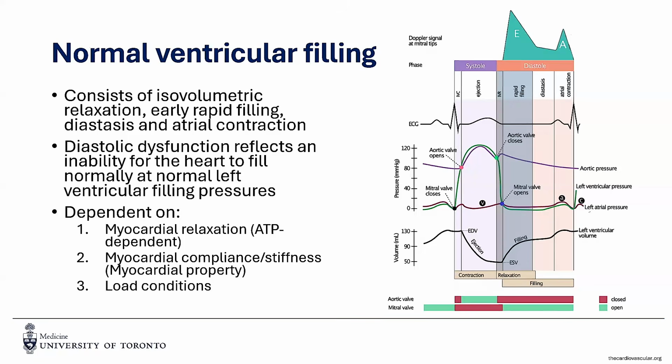And finally, the third determinant is the loading conditions. This one involves preload, afterload, and drives heart rate as well. And unfortunately, this preload effect is what limits our ability to use one single echocardiographic parameter in order to determine diastolic filling.